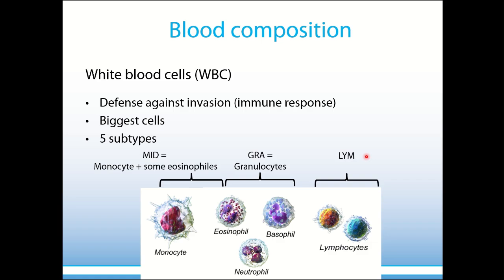Now, the CYANHemato analyzers are 3 differential analyzers, because no distinction can be made between the 3 granulocytes. For this, you would need a 5-diff device, using more sophisticated and costly measurement components such as a laser. So the CYANHemato analyzers will report the mid-sized cells, granulocytes, and lymphocytes, without making a distinction between eosinophils, basophils, and neutrophils.